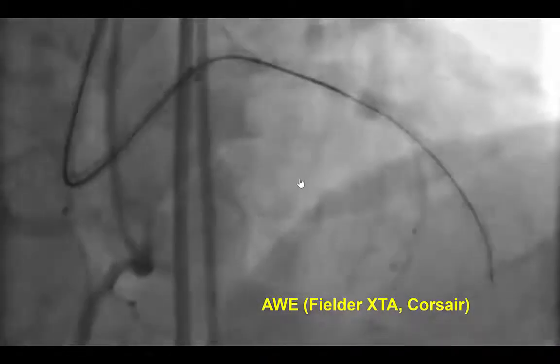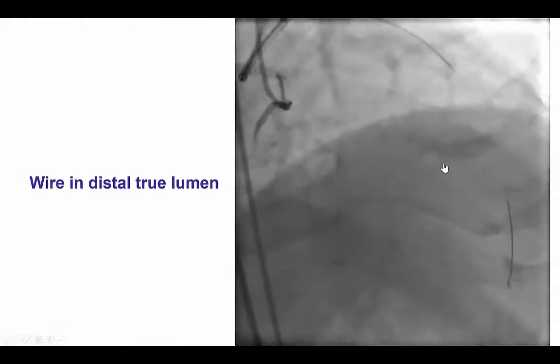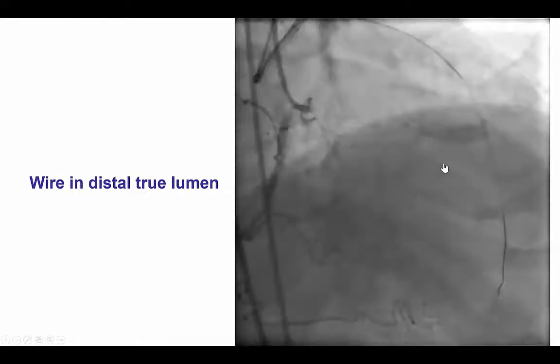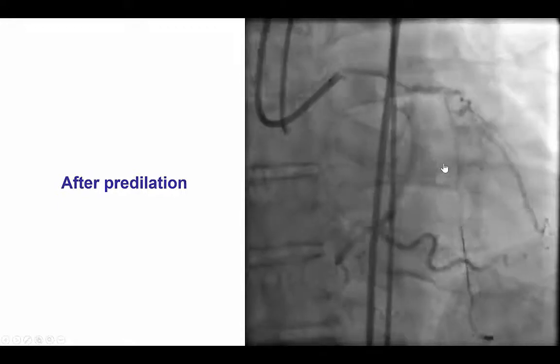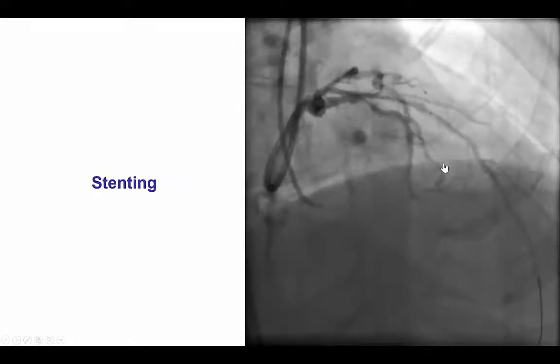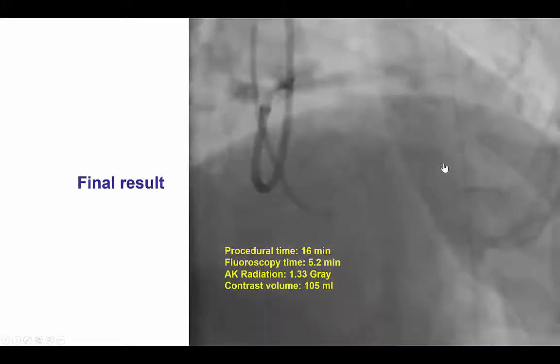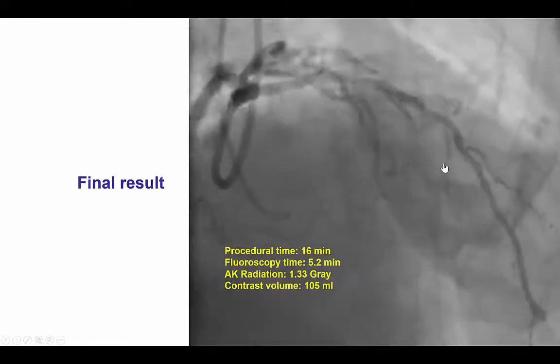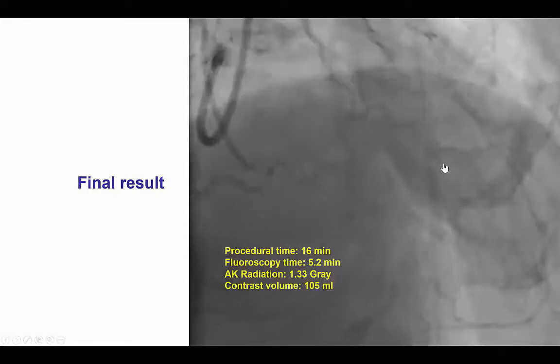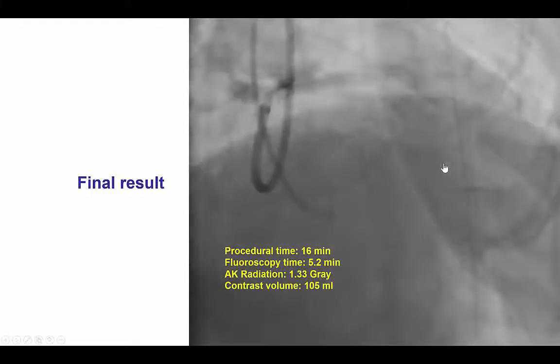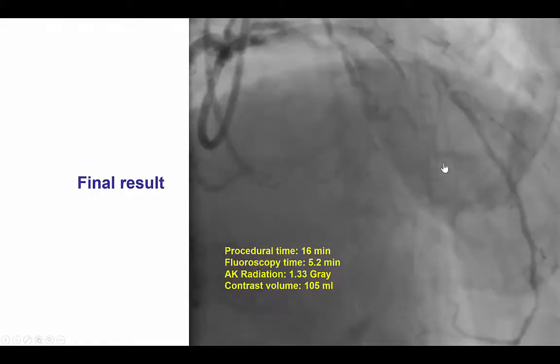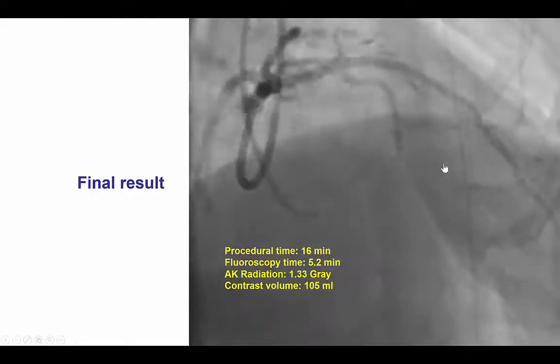We advanced a Fielder XTA guidewire, which easily crossed from the proximal cap into the distal true lumen, as confirmed by a contralateral injection in orthogonal projection. That was a very easy and quick crossing. The lesion was predilated, restoring antegrade flow, and was successfully treated with a single drug-eluting stent. The final result shows excellent TIMI 3 flow, achieved within 16 minutes of total procedure time, 5.2 minutes of fluoroscopy, 1.3 gray of radiation, and 105 mL of contrast.